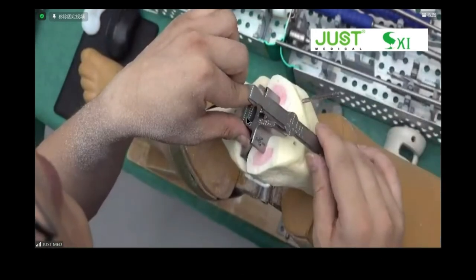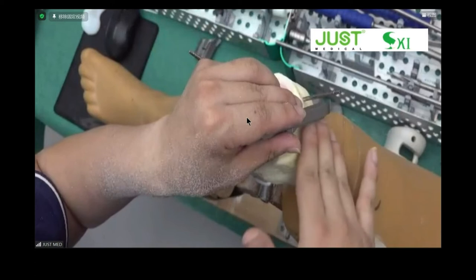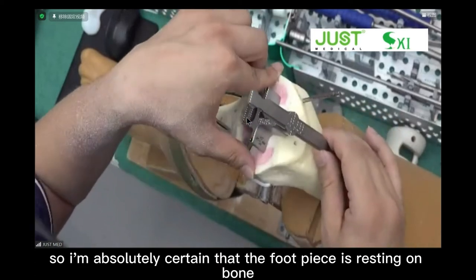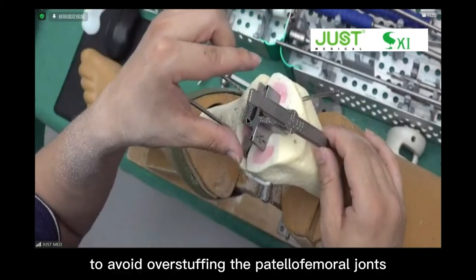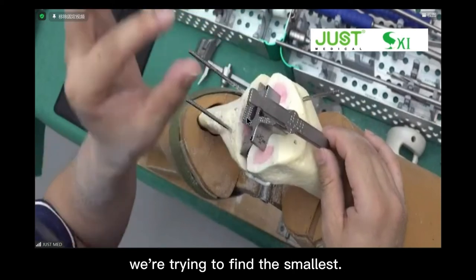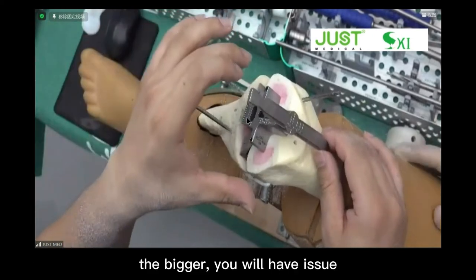Normally we expose the cortex distally and anteriorly, so I'm absolutely certain that the foot piece is resting on bone. That assures that I will put the smallest available femoral component to avoid overstuffing the patellofemoral joint. We're trying to find the smallest, as small as we can, to save more bone. The bigger it is, the more issues you will have.